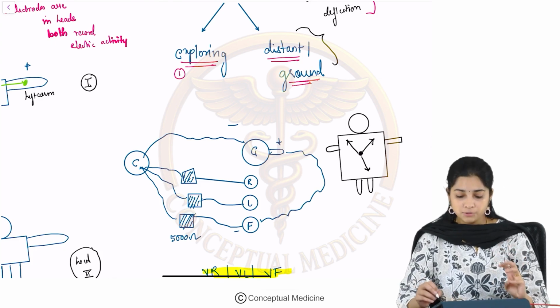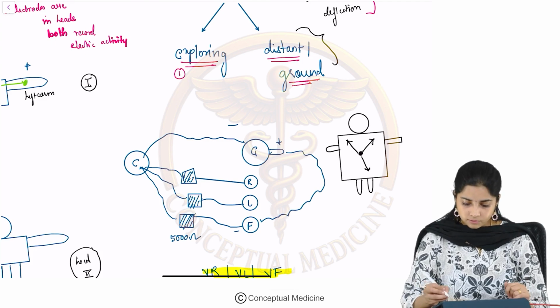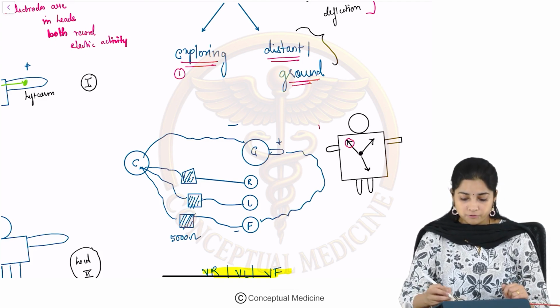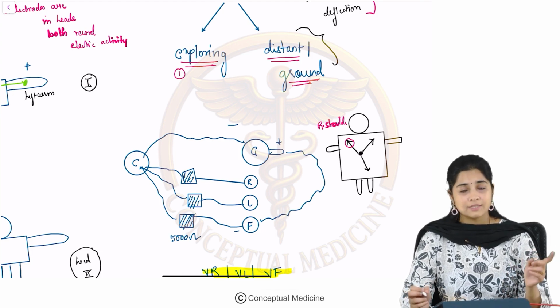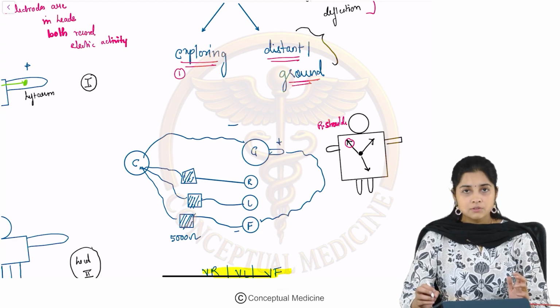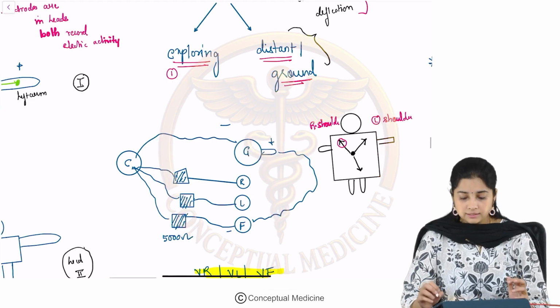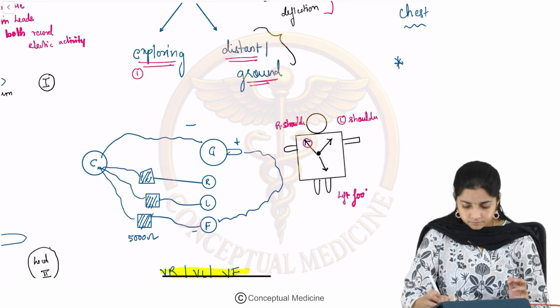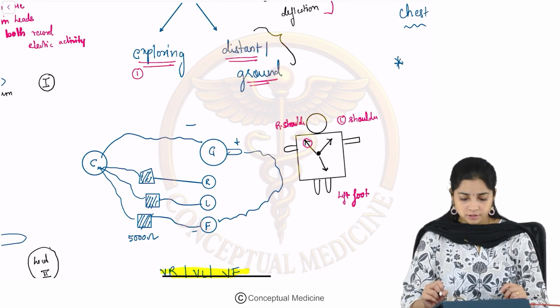There are three unipolar leads. They are also limb leads. One detects the direction of flow towards the right shoulder, the other towards your left shoulder, and the other detects the deflection towards your left foot.